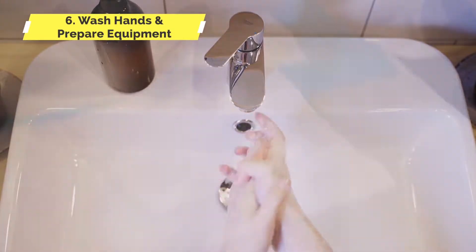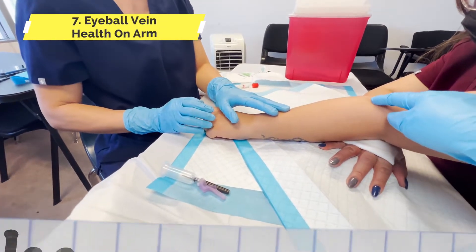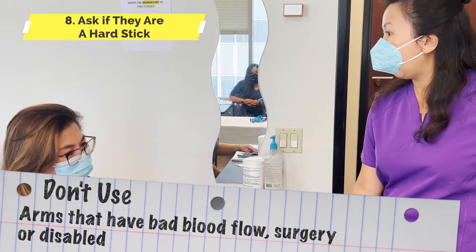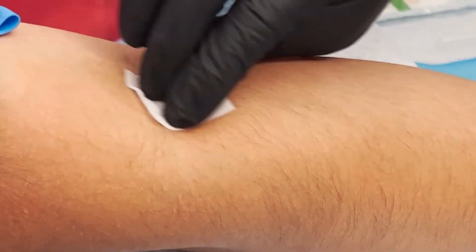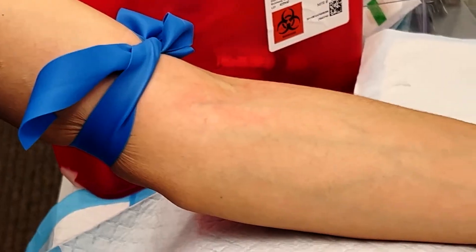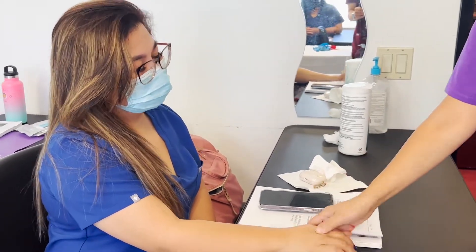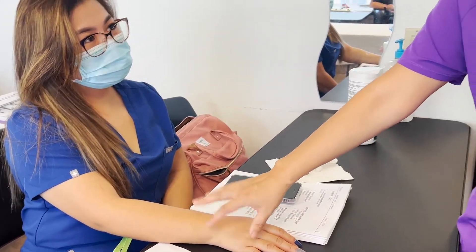Let me wash my hands. I have all my equipment ready. So can I just check your veins? Before I put on a tourniquet, have you ever heard of the term hard stick? So you usually don't like it there because of the radial nerve. We usually don't put the IV there as much as possible. In an acute hospital, we start with the hand just in case this blows, we can work our way up.